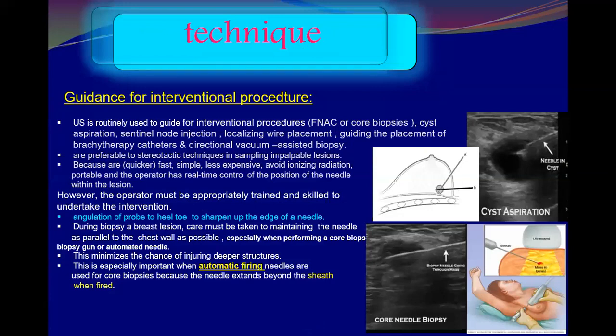Ultrasound, as you know, is the best, or routinely used, modality for interventional procedures of the breast: FNAC or core biopsy, cyst aspiration, sentinel node injection, localization wire placement, guidance for placement of brachytherapy catheters, directional vacuum assisted biopsy, and so forth.